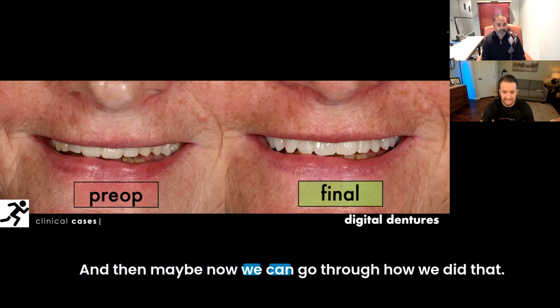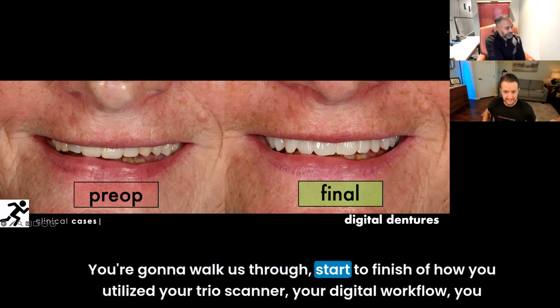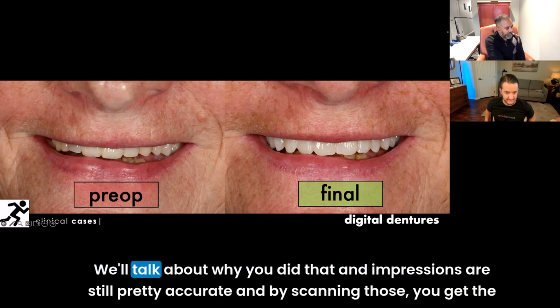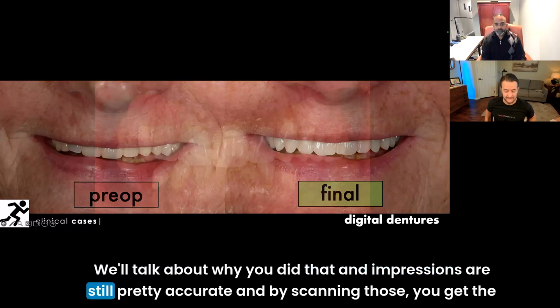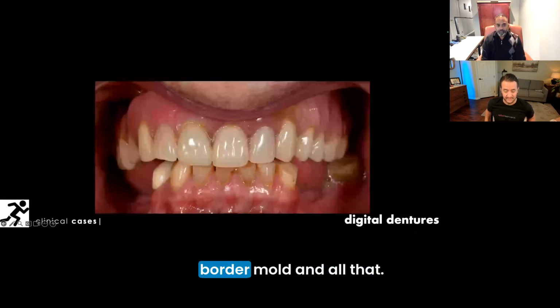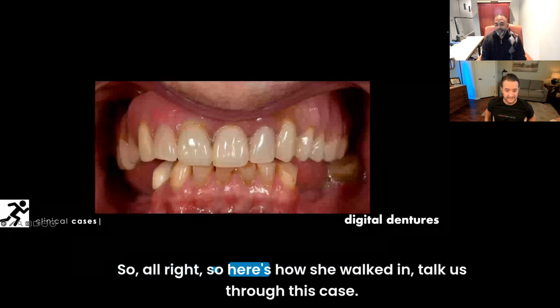And then maybe now we can go through how we did that. You're going to walk us through, start to finish, how you utilized your TRIOS scanner, your digital workflow. You did take impressions on this case. We'll talk about why you did that. Impressions are still pretty accurate, and by scanning those, you get the border mold and all that. So, all right, here's how she walked in. Talk us through this case.